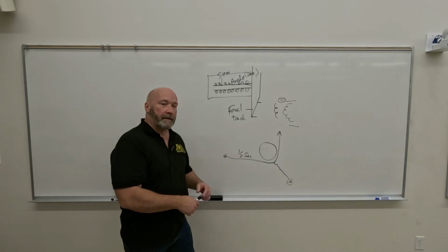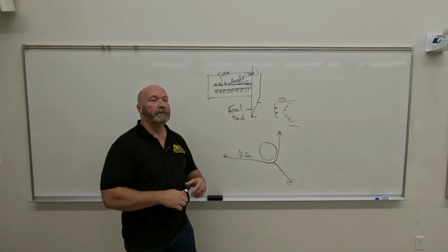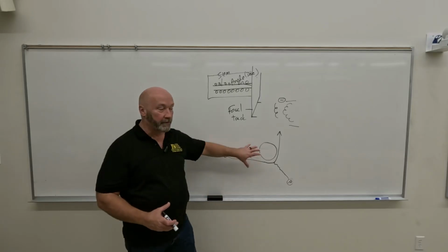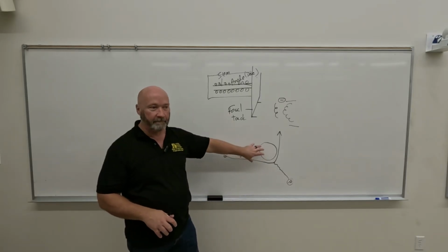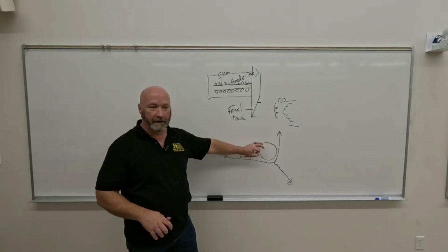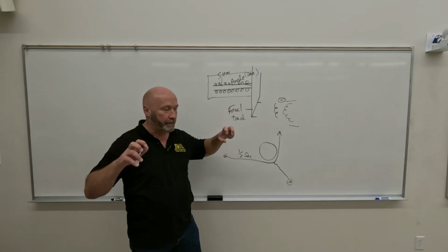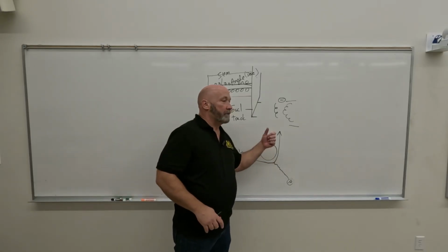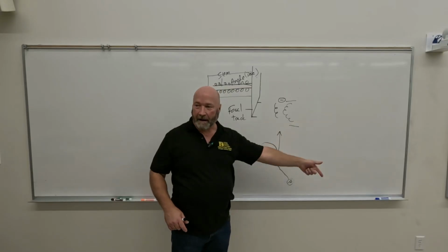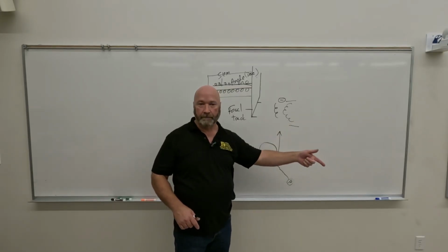So now back to atomic number. What do you know about atomic number? The higher the atomic number, the bigger the nucleus, and the bigger the gravitational pull. Now we've got Venus instead of Mercury, right? We've got a great big fat nucleus with a big gravitational pull, so to speak. So the electron gets close to it, it can lose more energy, and we can have a higher energy X-ray photon. We need high atomic number.